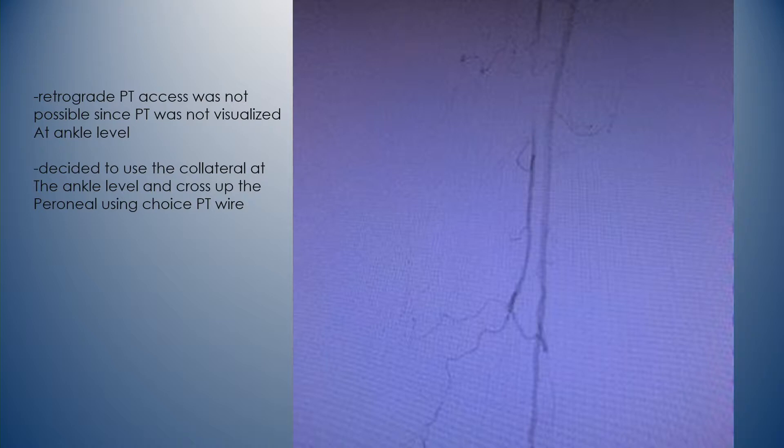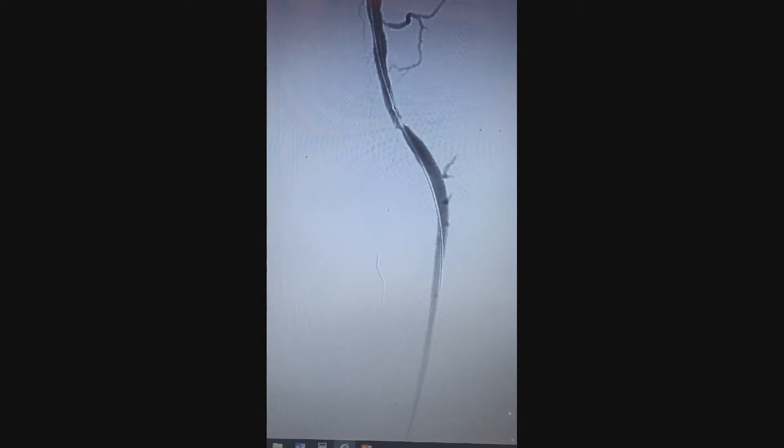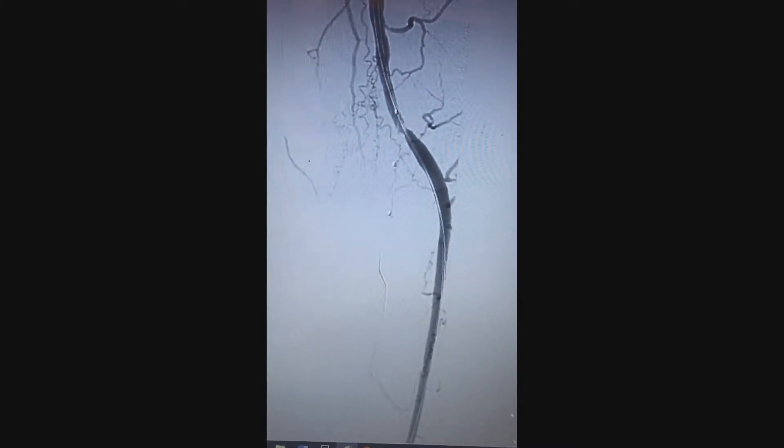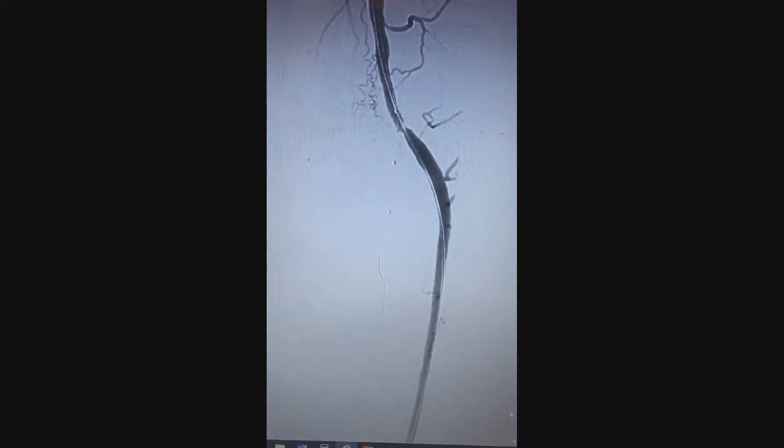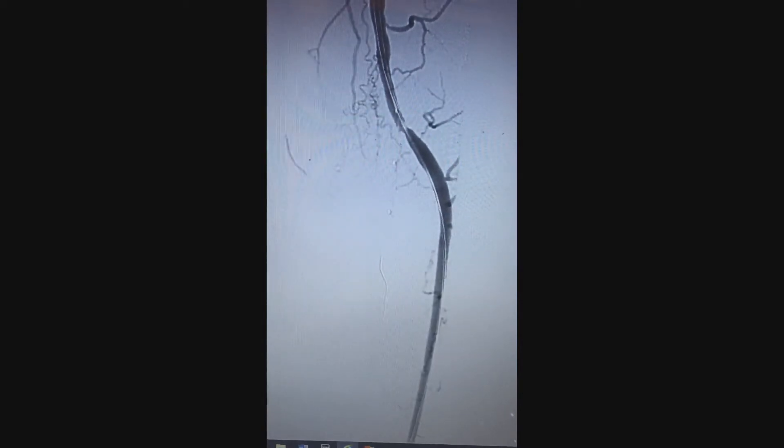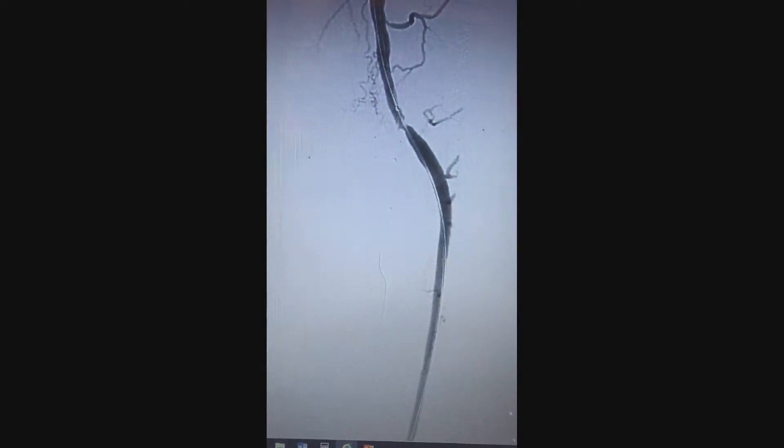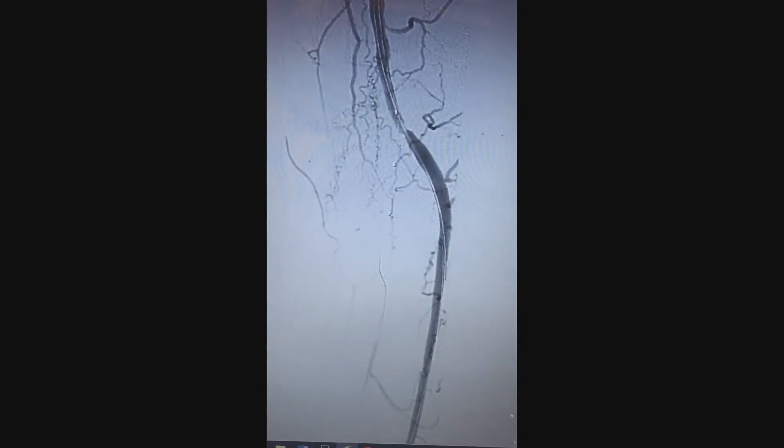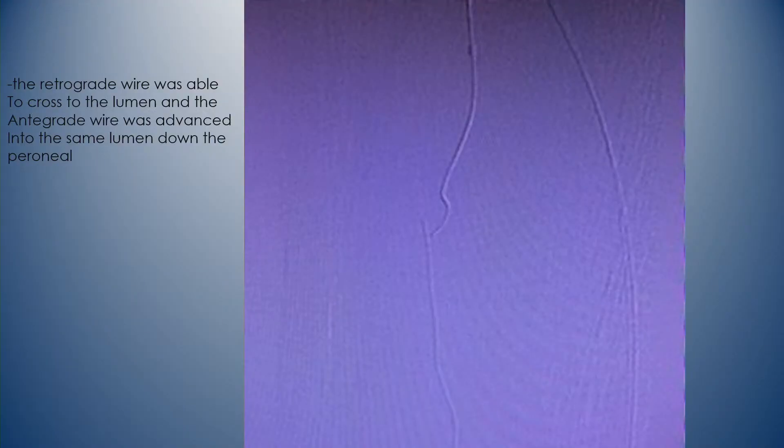So what I did is I passed a choice PT wire with an 014 quick cross. The quick cross actually got to this point and would not go any further. I ran out of length, but the choice PT was able to make the loop and go back up, just about to the occlusion area. The problem here was there was really no pushability because I didn't have any support catheter. After multiple trials, I was able to form a knuckle in that area and just kept pushing the choice PT, was able to dissect and go through, and then I was able to push the antegrade wire from above into the same dissection plane. So I was able to cross antegrade.